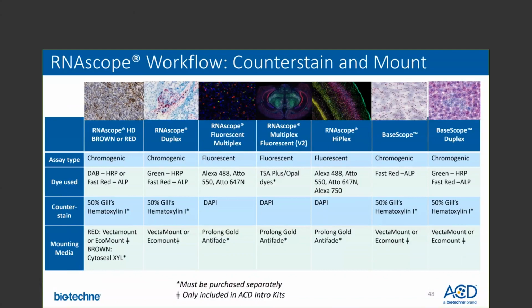Either VectaMount or EcoMount are compatible with our RNAscope singleplex red, RNAscope duplex, BaseScope singleplex, or BaseScope duplex assays. Lastly, for our fluorescent-based assays, we recommend the use of ProLong Gold Antifade for mounting. Please note, the ProLong Gold Antifade mounting media requires time to cure before imaging.